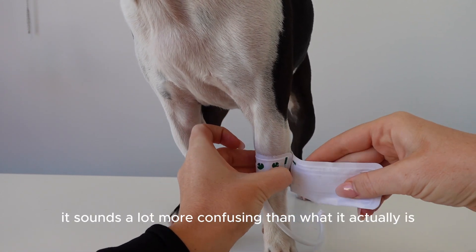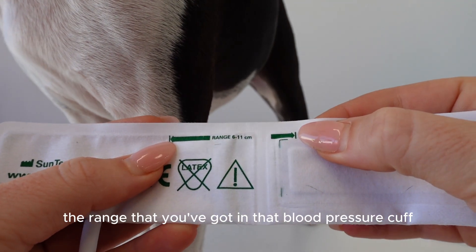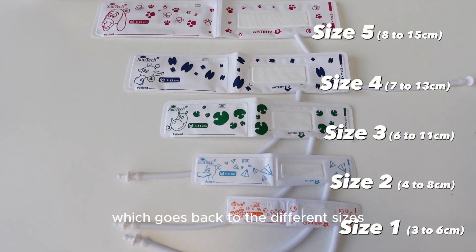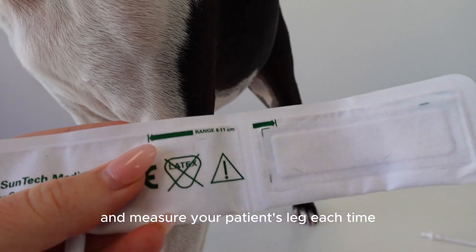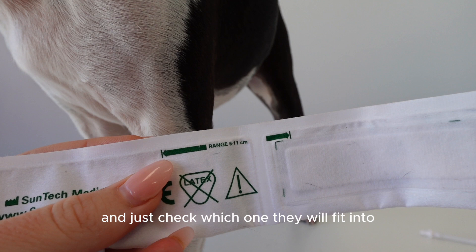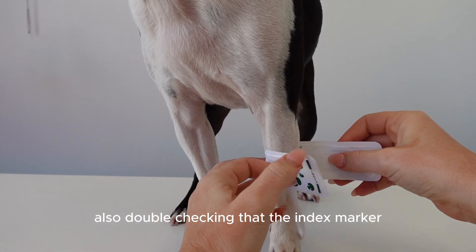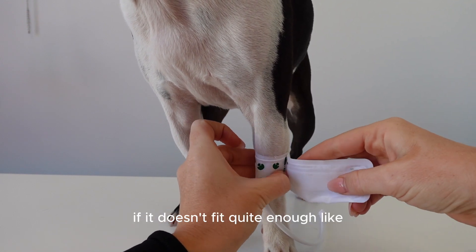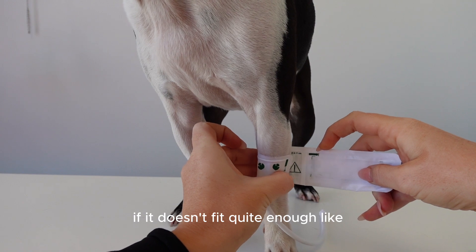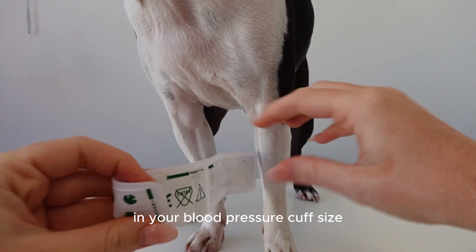The second way is using the size range marked on the blood pressure cuff. You measure around the leg with a measuring tape and check which size the patient fits into. Also double-check that the index marker on the blood pressure cuff falls within that range. If it doesn't fit quite right, go up or down in cuff size accordingly.